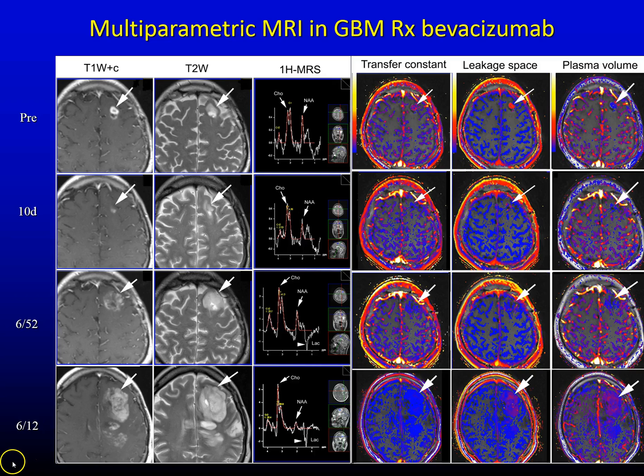effect on the tumor. However, if you looked at the transfer constant, which, remember, represents the leakiness of vessels, what you observe was that there is a reduction in transfer constant that is in fact maintained. So the drug does work. The drug is meant to reduce vascularization, and in fact we can show quite convincingly that there are sustained reductions in the vascular permeability.